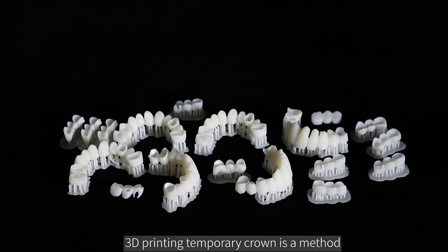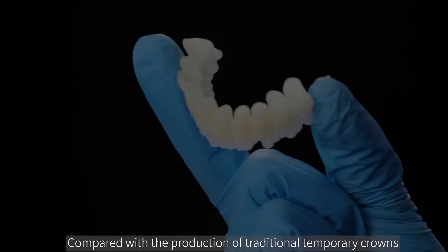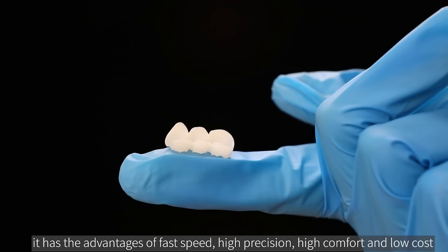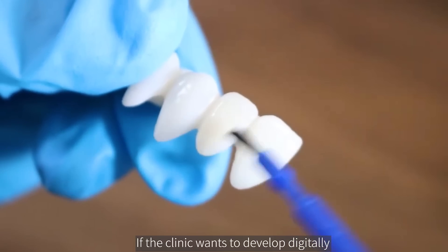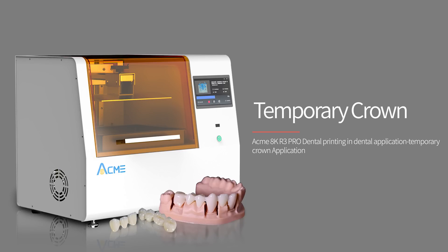3D printing temporary crowns is a method of digitally producing temporary crowns. Compared with the production of traditional temporary crowns, it has the advantages of fast speed, high precision, high comfort, and low cost. If a clinic wants to develop digitally, introducing relevant 3D printing equipment is very necessary.